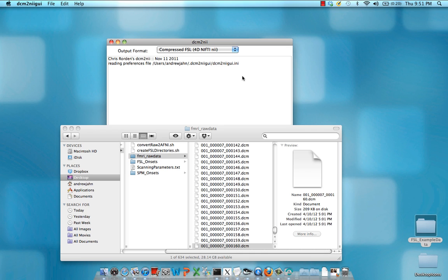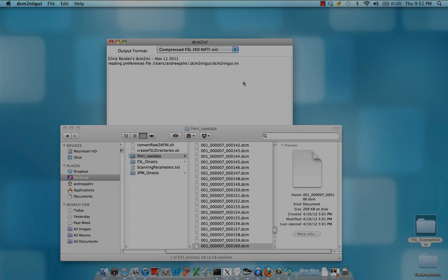It'll start converting. The conversion for very large datasets can take up to several minutes, so be patient.